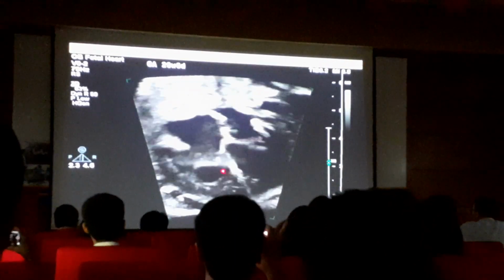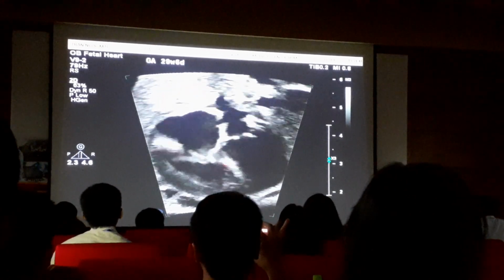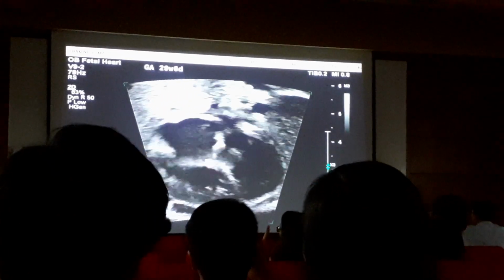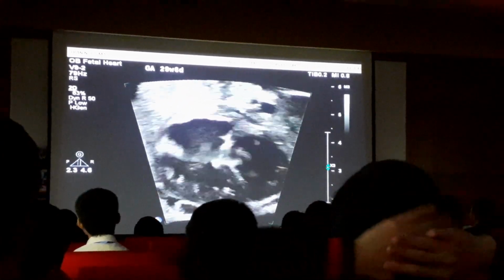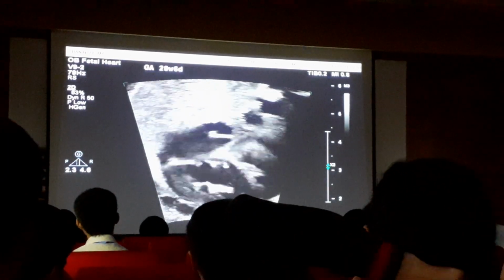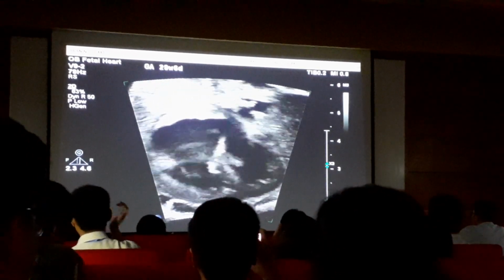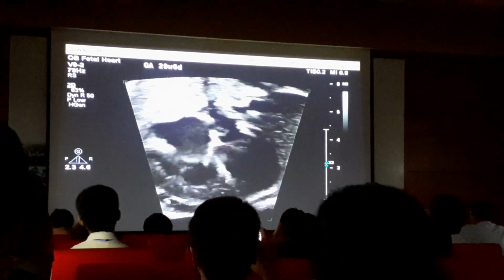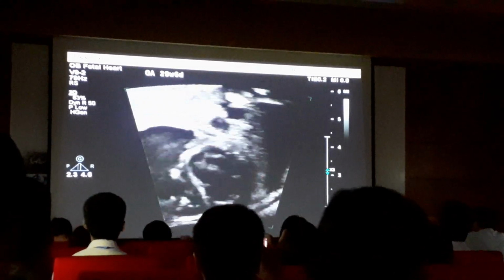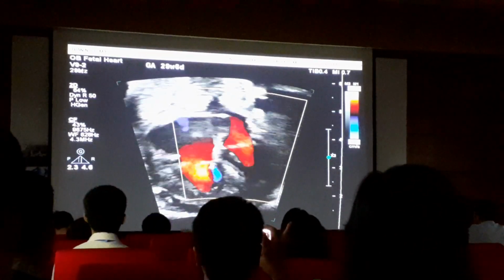And actually that velocity jet is predicting a right ventricular pressure that is quite high, not the right ventricular pressure you would expect from RV failure or from primary tricuspid valve disease. So the pressure is very high, meaning it is not due to right ventricular failure or tricuspid valve damage, but due to something behind it.